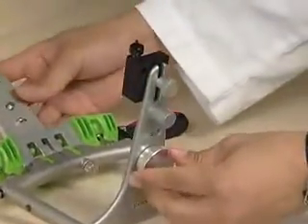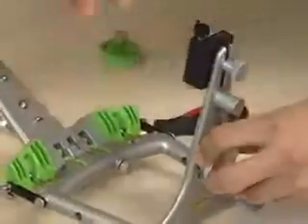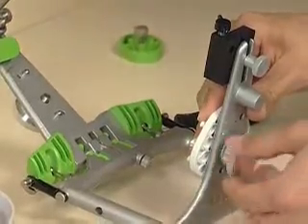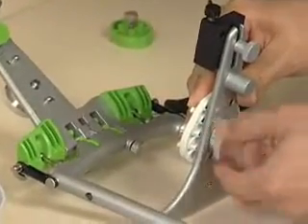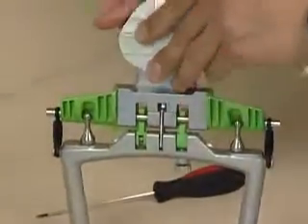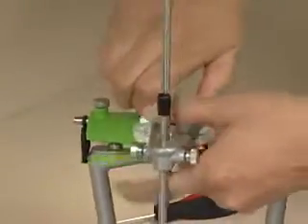And now we'll put in both the upper and the lower mounting plates. You want to tighten those very, very good on the articulator. Make sure they're seated properly and it's tight.